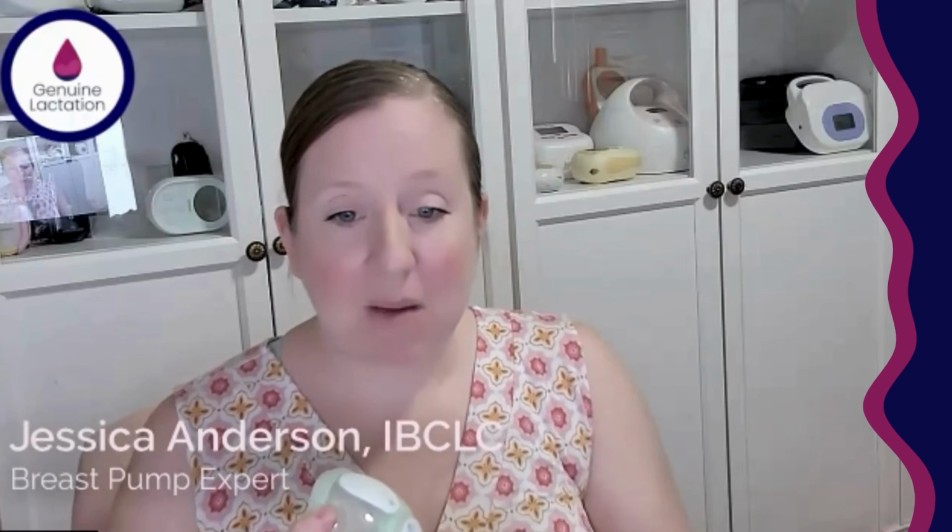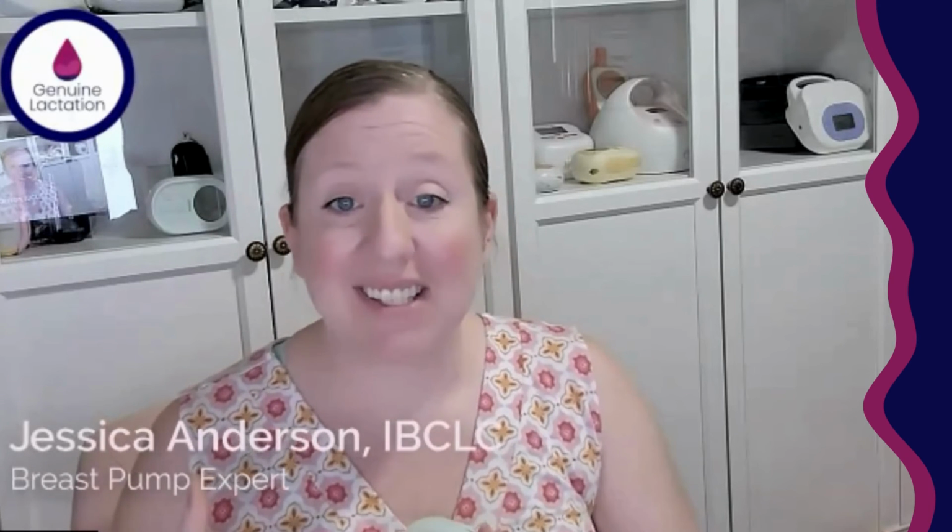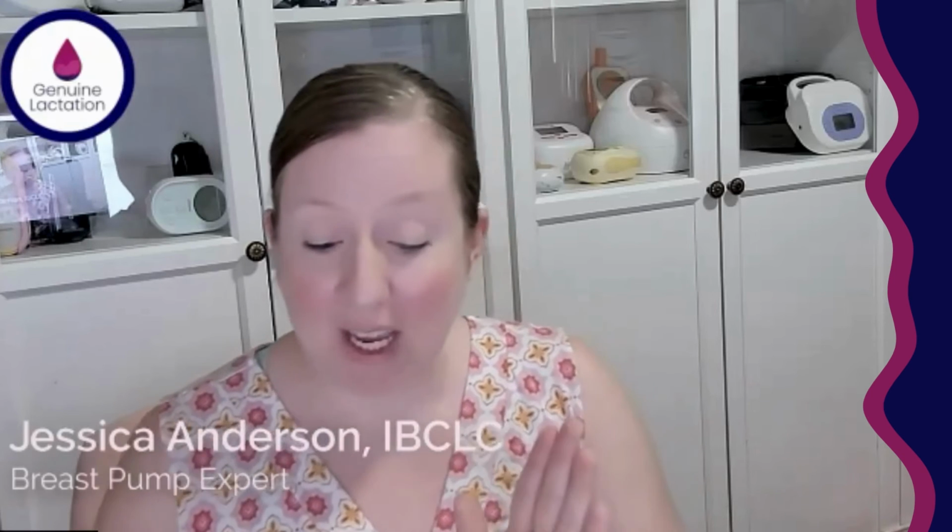There is a generic diaphragm, it's pink, by a company called Yeah Better. I have mixed thoughts on that one. When I'm testing it and putting it on the pressure meter, some of them are getting really good suction, others are not. And I do see an increased incidence of leaking because the diaphragm is not quite as flexible. So, especially if we're pairing it with a stronger motor, then we can end up with the cup having more issues with leaking.